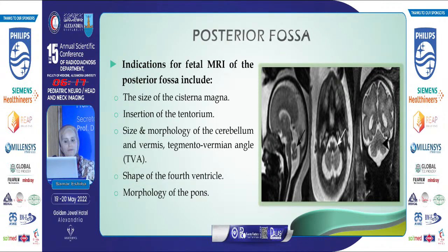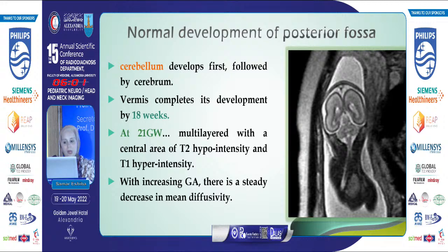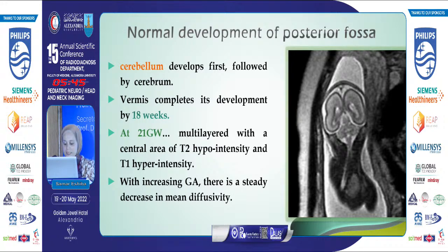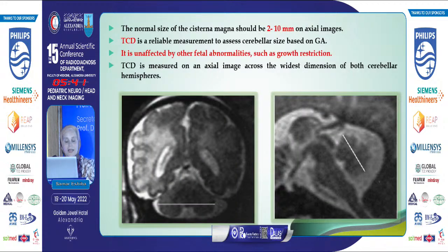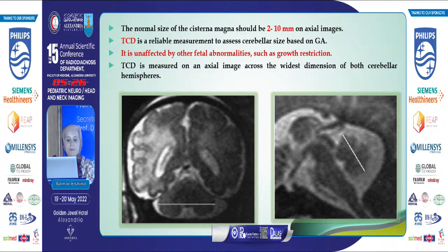The most common indications for fetal MRI regarding the posterior fossa include assessing the size of the cisterna magna, insertion of the tentorium, the size and morphology of the cerebellum and vermis, the shape of the fourth ventricle, and the morphology of the pons. In normal posterior fossa development, the cerebellum develops first, followed by the vermis, which completes development at 18 gestational weeks. At 21 gestational weeks, the cerebellum appears as a multilayer pattern with a central area of T2 hypointensity and T1 hyperintensity. Normal cisterna magna should measure between 2 to 10 mm on axial imaging, and the transcerebellar diameter assesses cerebellar size based on gestational age.